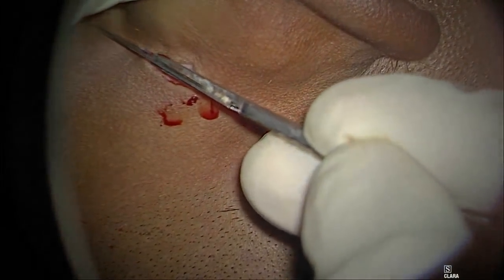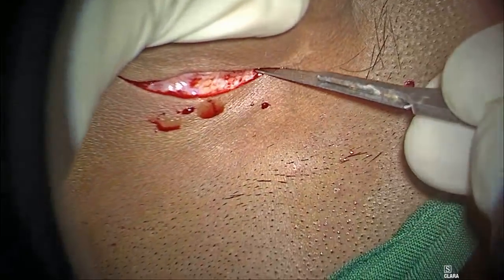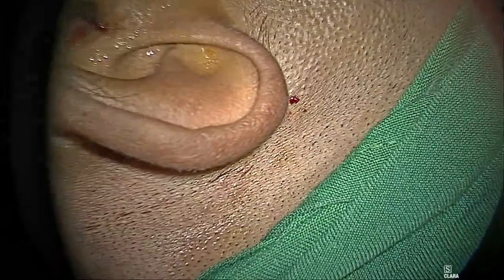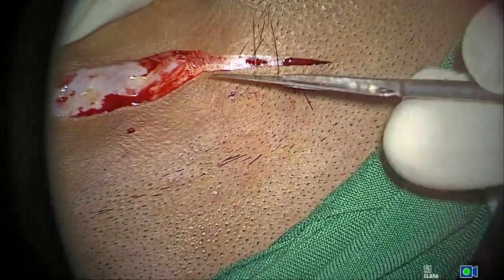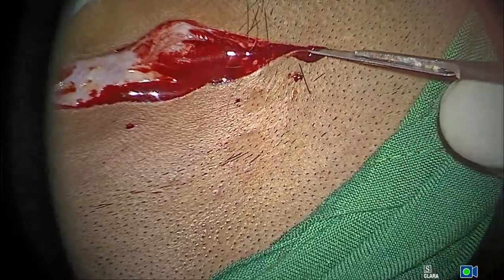It's a Wilde's postaural incision. I go along the groove, so you can see that I go along the groove, and once I go, I just extend a little for the graft. You can see that I just extend that a little bit for the graft there. That's it.